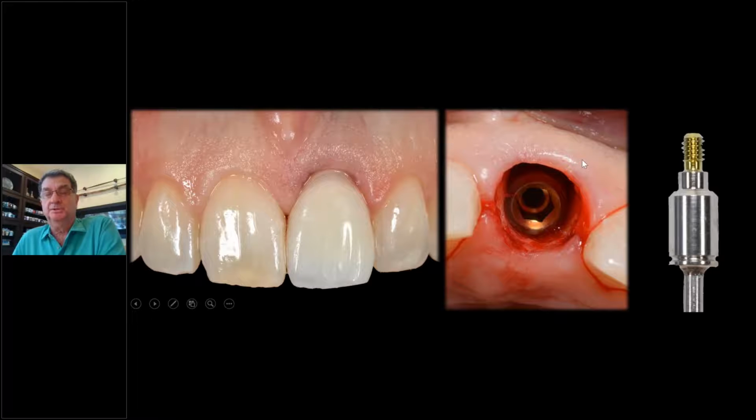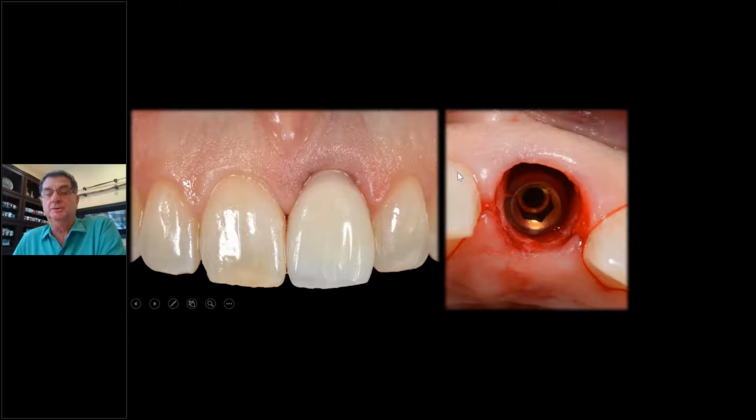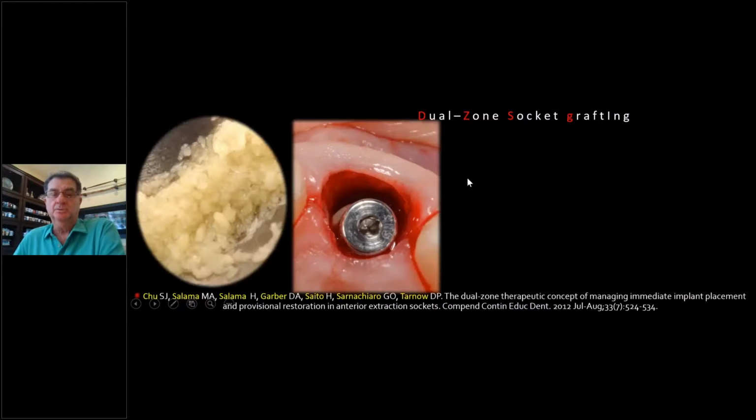Now this buccal plate is here, but I can't get to it. Look at the left screen. I can't get to it because the temporary is in the way. So while this is being stained, I wanted to put a straight healing abutment on, as you see here. Now I can pack the bone. And we use small particle cancellous bone because the chips are great if you have the room for it, but I want something that I can get in there all the way up inside this crevice right in here. So we do use small particle cancellous bone because we're going to do something different.